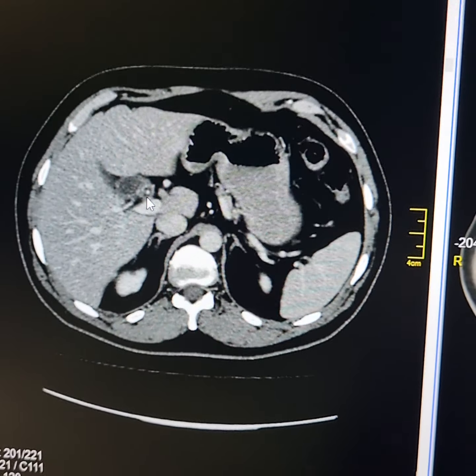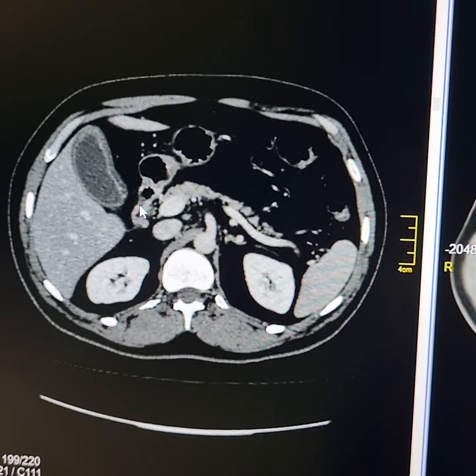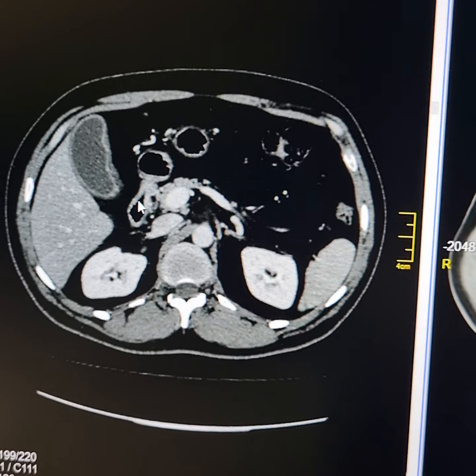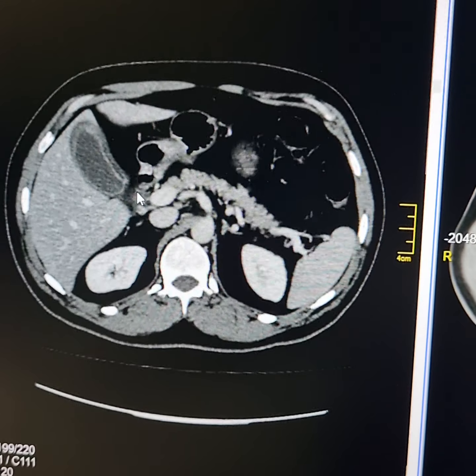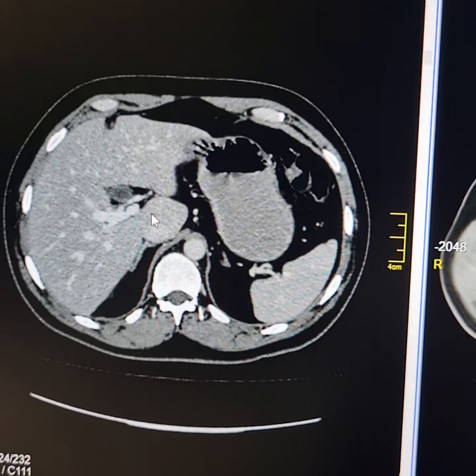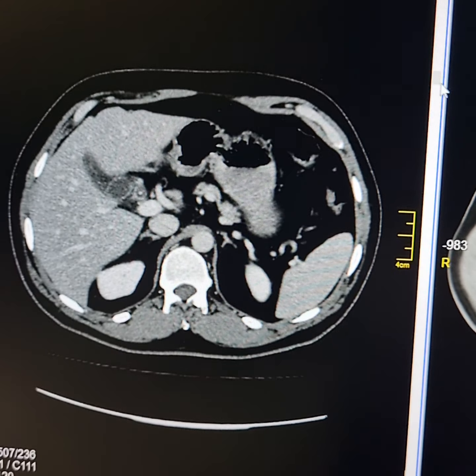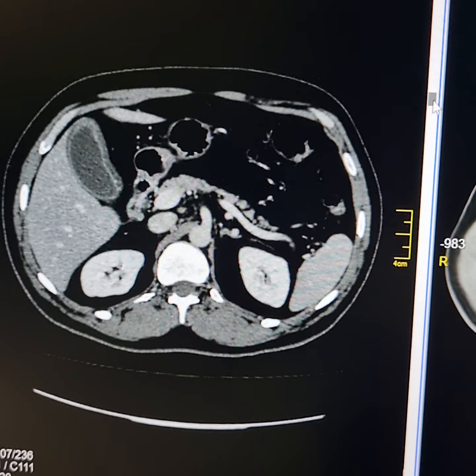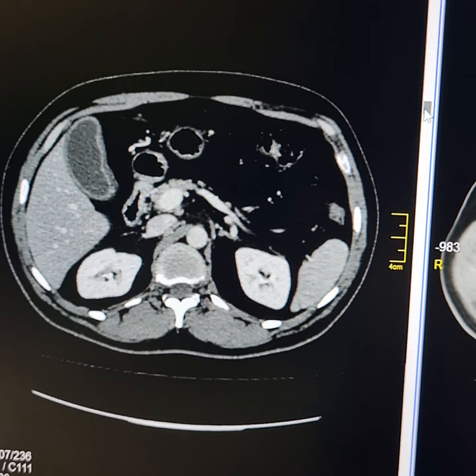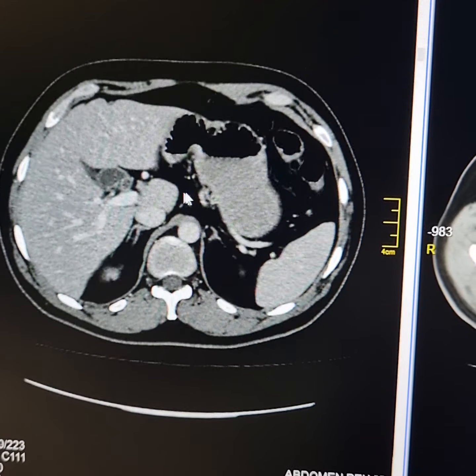So in my humble opinion, if there is acute cholecystitis, sludge in the lumen of the gallbladder, wall thickening, perigallbladder edema, lamellation of the wall of the gallbladder, that is, all the signs and symptoms of acute cholecystitis are there clinically as well as upon the ultrasound, one must always give a guarded opinion that since the gallbladder is hugely distended or the patient is very obese, very thick, the possibility of a small calculus in the region of the neck of the gallbladder cannot be excluded.